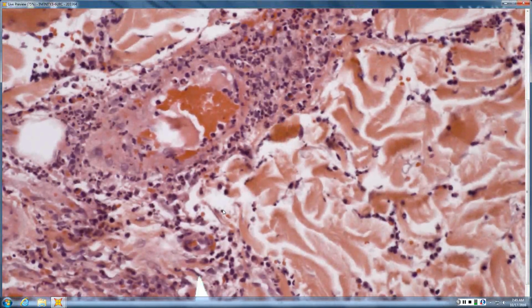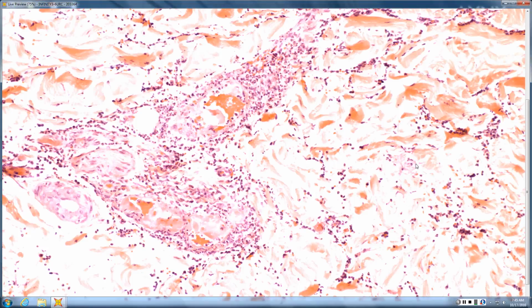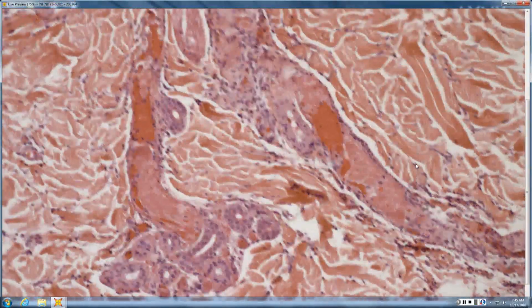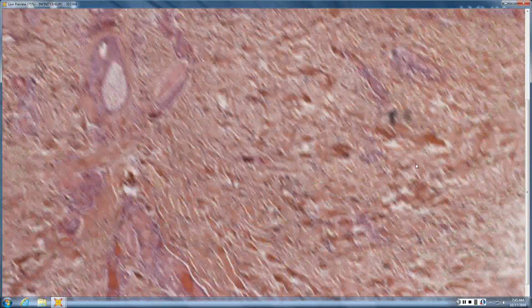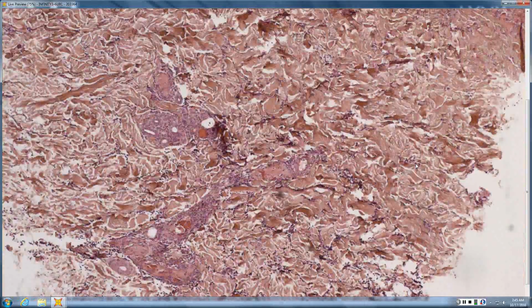Neutrophils and eos. How happy is your vessel? Not very happy. So you have an unhappy vessel. Is that thrombus inside the vessel? Marked thrombi. In fact, if you go back to the other vessels, marked thrombosis. Karyorrhexis as well. Yep. So like another in the vasculitis range with a thrombus, maybe like septic vasculitis. So vasculitis with thrombi, septic vasculitis, absolutely.